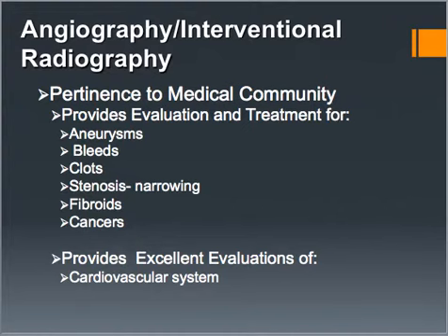The pertinence to the medical community is pretty big. So it's a fairly quick, minimally invasive study that allows the patient to not have to undergo surgery. It can be done on an outpatient basis, which makes the procedure a little bit easier, and it makes it cheaper for the patient and the hospitals. But it provides excellent evaluation and treatment for aneurysms, bleeds, clots, fibroids, stenosis, and cancers.